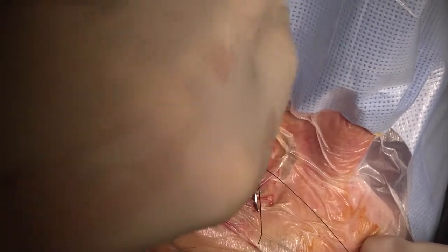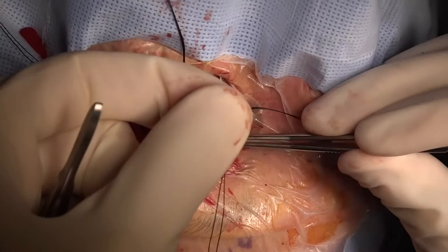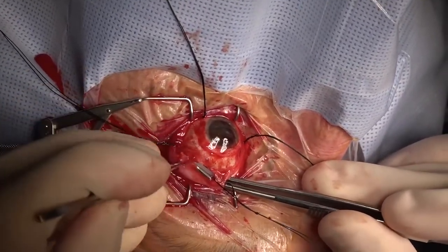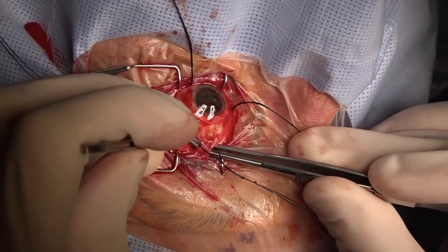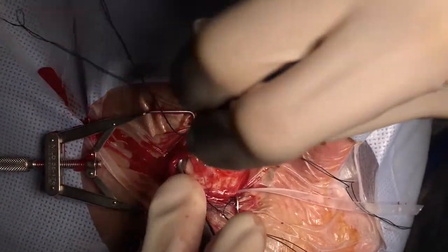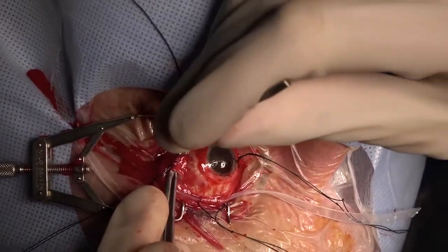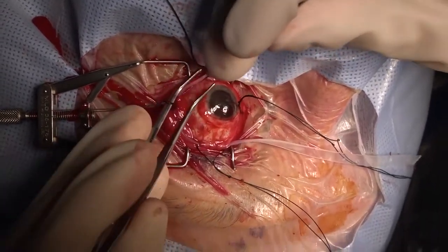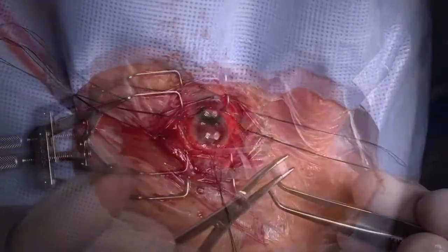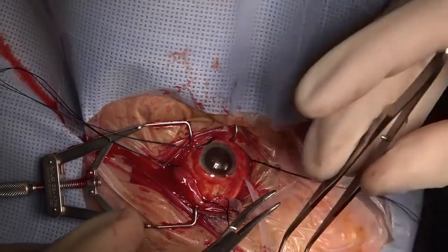The same procedure is repeated for all four rectus muscles. After all four of the rectus muscles have been looped, we're going to place the encircling band. The band we're using is a number 41 silicone band, and we're gently and carefully passing the end of the band around all four of the rectus muscles. We're making sure that the band is not twisting as we pass the muscles, and we've cut the band in a puzzle cut matching slanted configuration to make sure that the ends have met and there's no twist.